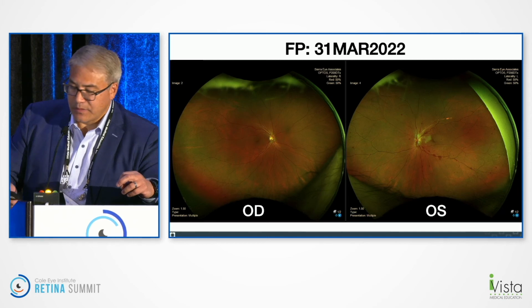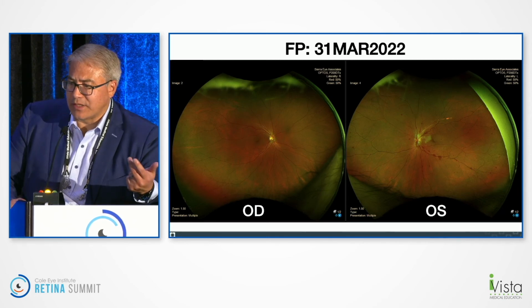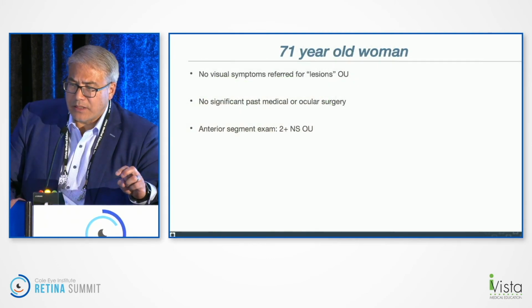Yeah, there's venous tortuosity. It's more just the fact that this was after the COVID vaccine, and we're starting to see, obviously, many people have seen vascular changes after that. All right, that was easy.